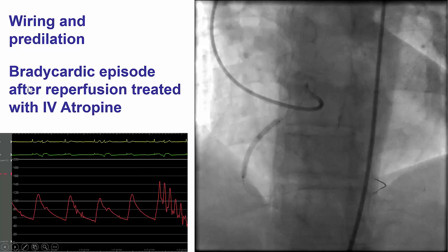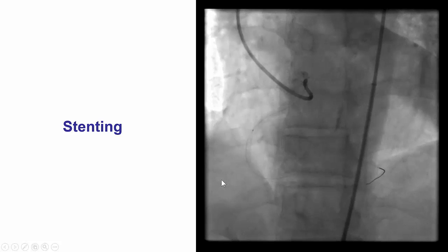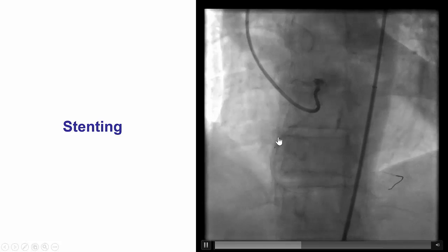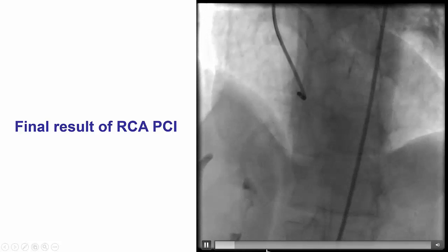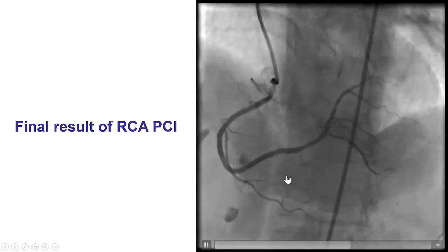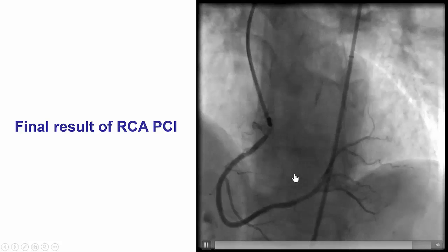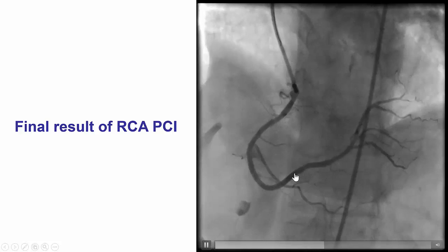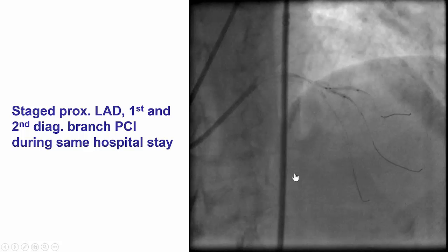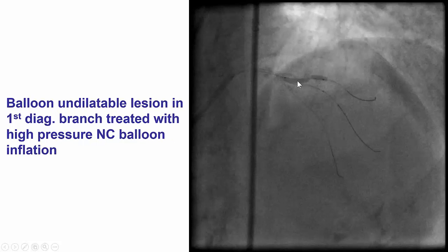The patient did have a bradycardic response after stenting and required atropine, but had an overall good result with restoration of TIMI flow and resolution of the ST-segment elevation. Later in the same hospitalization, he underwent successful PCI of the LAD diagonal bifurcation.